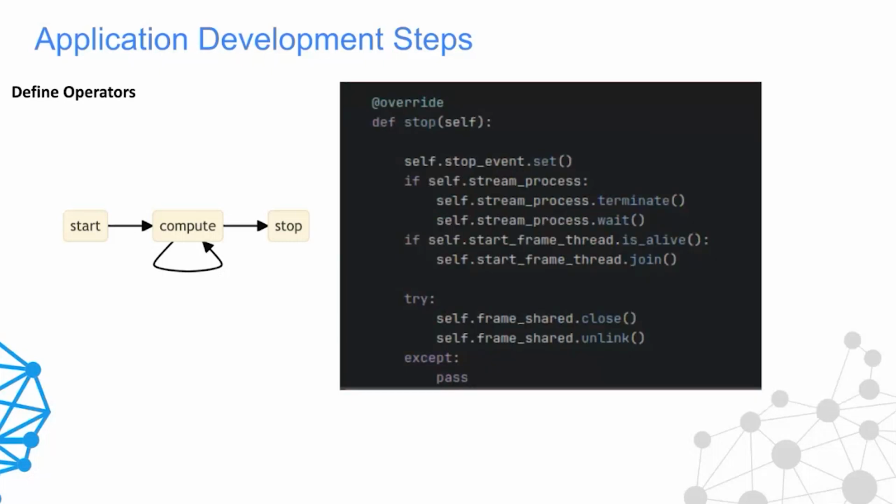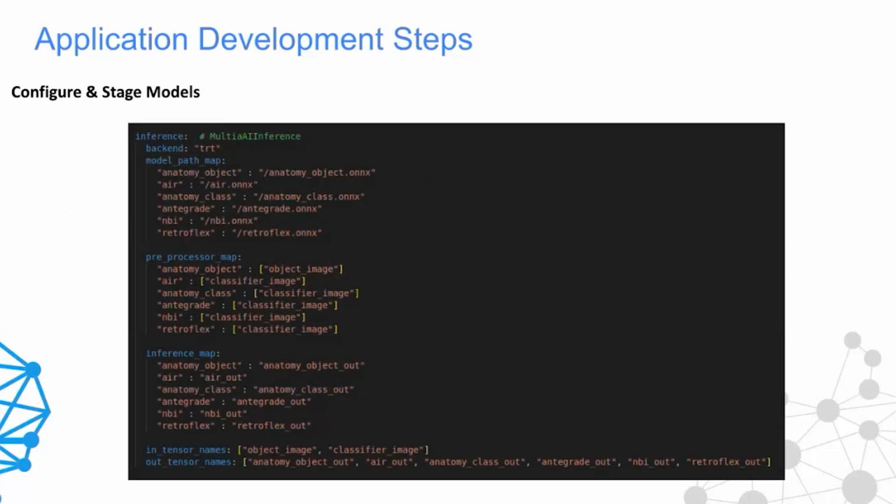The stop method is where, in this small implementation, we have a stream running. Before we end the Holoscan application, we want to free up all that memory and any other resources that the streaming operator is using. So this is a good example of implementation of the stop method.